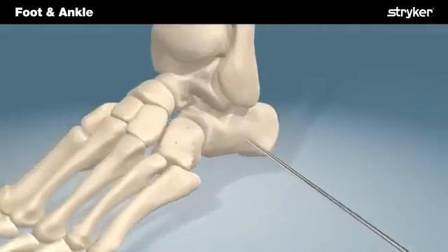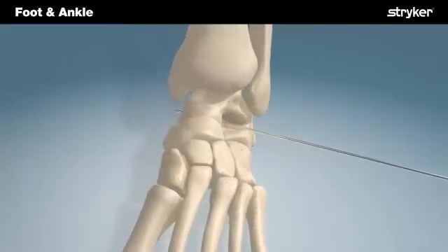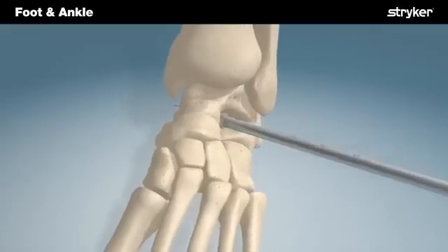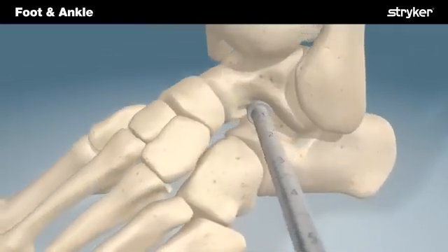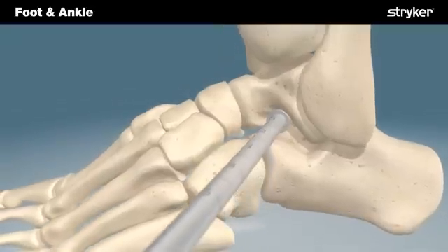The 2.0 mm cobalt chrome implant rod is inserted into the sinus tarsi until the implant rod is felt at the medial aspect of the hindfoot. A trial sizer is placed over the implant rod and inserted into the sinus tarsi. Clinical exams should reveal normal hindfoot motion. If the hindfoot is too stiff, a smaller trial should be selected and clinical exam repeated.